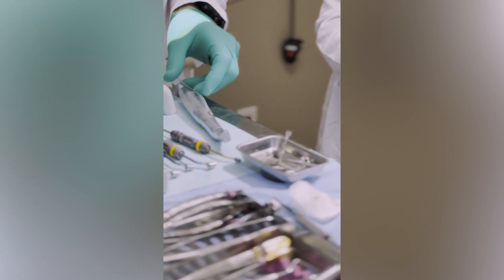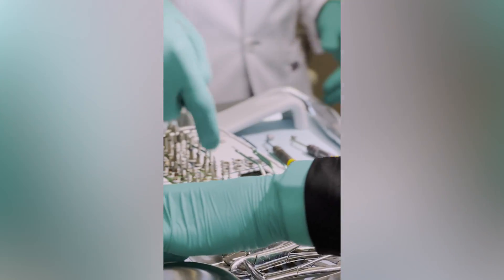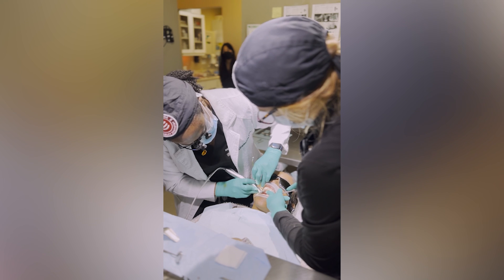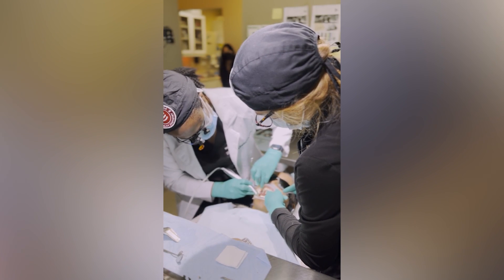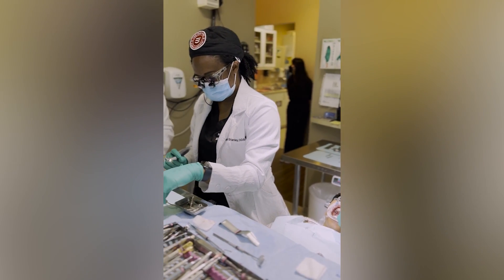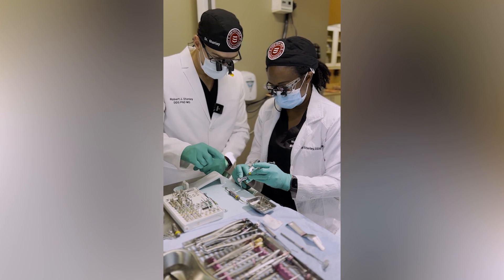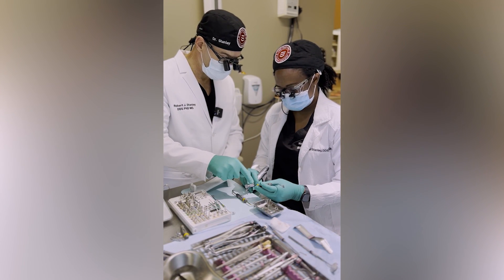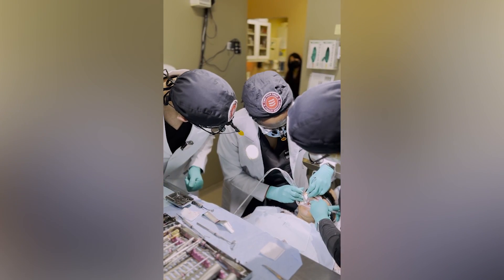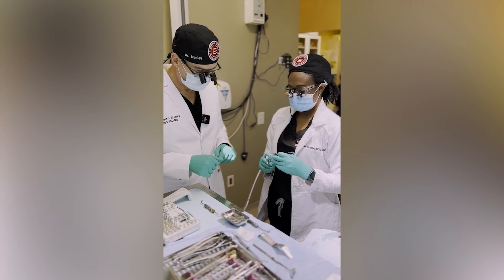The next one on the sheet is the 3.2, and the 4 position is 21. So we're going to go to the 21 row. The 2.8 on 21 — let's do the 2.8 on 21. Push on it — there you go. As soon as it touches all the way to depth, you're done. You don't have to hang out. Now we need the same length for the blue. The smaller implants use the gold, the bigger implants use the blue. If you have a blue master cylinder — the hole in there — you have to use the blue cylinder. Push it, and it's going all the way down. The osteotomy is done.